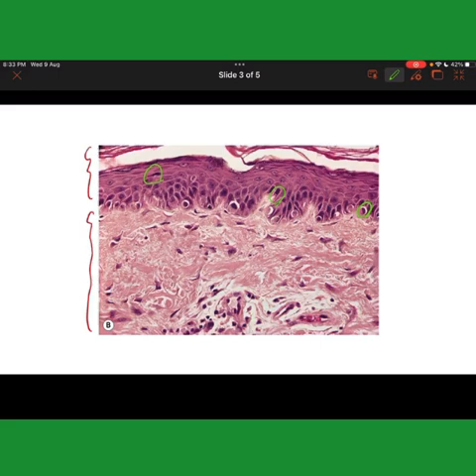When this kind of cell death occurs in the epidermal cells, we call them sunburn cells, or keratinocytes damaged by sun exposure. So these are apoptotic keratinocytes. What else do you see?